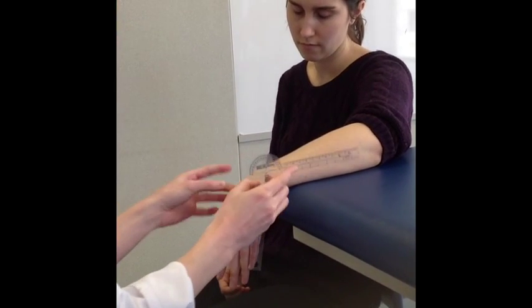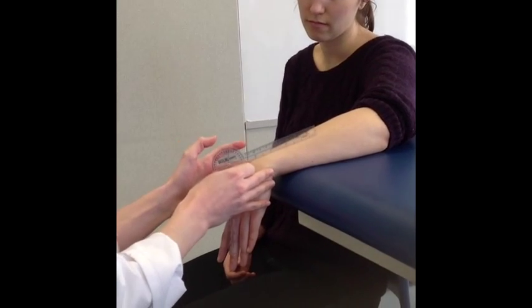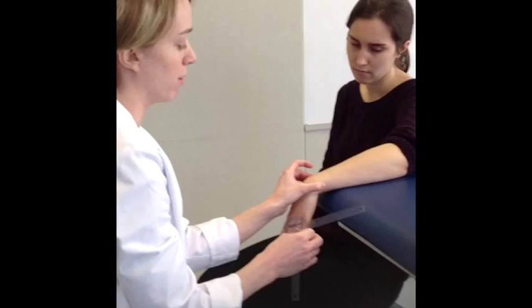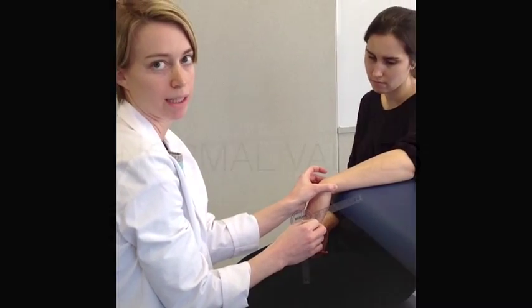Throughout this, you want to be making sure that the patient's wrist is stabilized between pronation and supination. If you need to, you can stabilize with the radius and the ulna. Average wrist flexion is generally between 60 to 80 degrees.